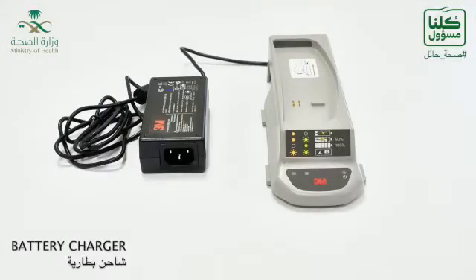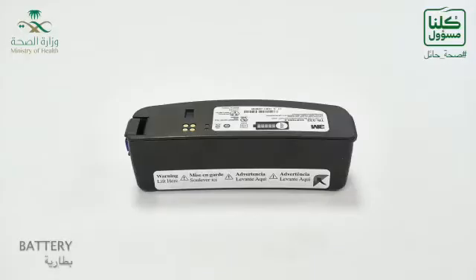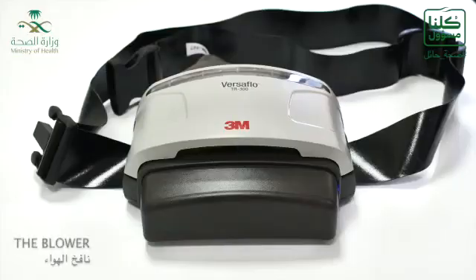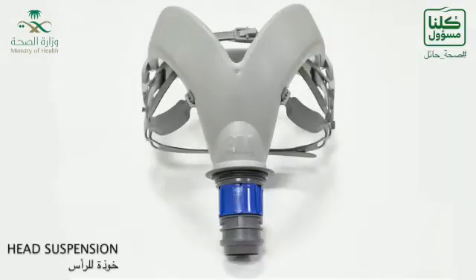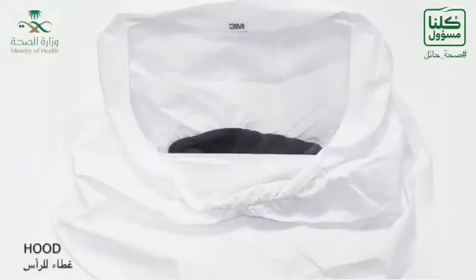The parts: this is the charger for the battery, this is the filter, this is the battery, and this is the breathing tube. This is the blower and the flow indicator, the head suspension, and the hood.